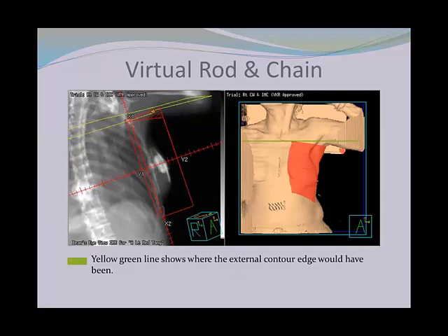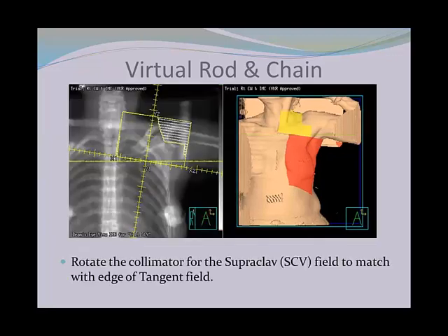One thing I want to point out is that in this case, it's the left chest wall. For our IMC field, we actually split the IMC field into 2 fields, the upper IMC and the lower IMC. Usually for a left chest wall case, the physician likes to use a higher energy on the upper IMC field to get the coverage that we need. For the lower IMC field, usually we just want enough electron energy to cover the tissue needed. Usually the coverage is just anterior to the muscle, and by using a lower electron energy, we're able to reduce the dose to the heart.